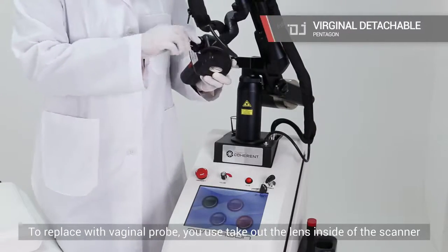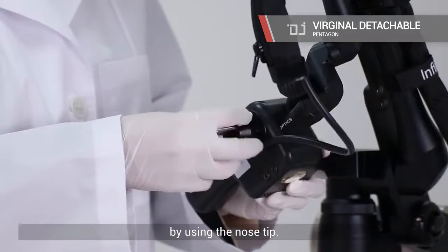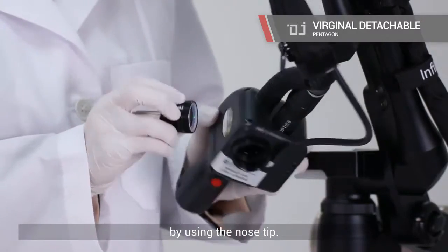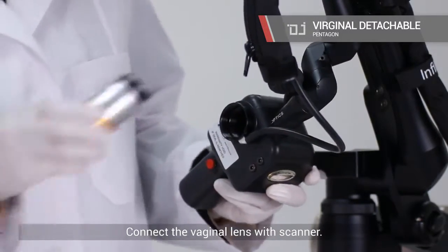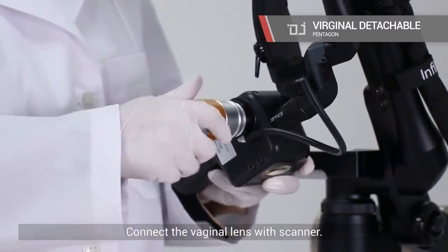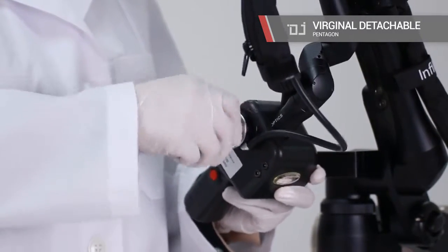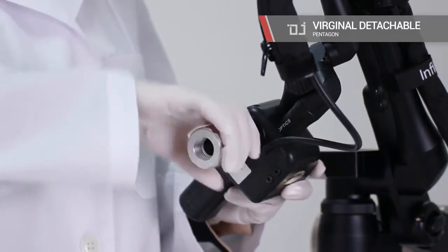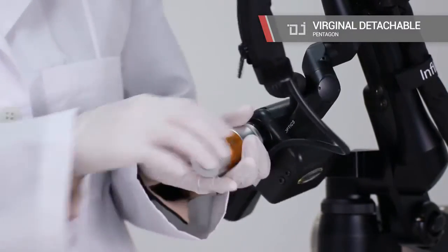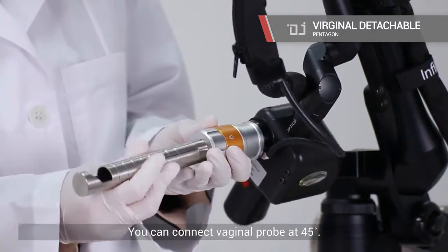To replace with the vaginal probe, take out the lens inside of the scanner by using the nose tip. Connect the vaginal probe with the scanner. You can connect the vaginal probe at 45 degrees, and you can also connect it at 360 degrees.